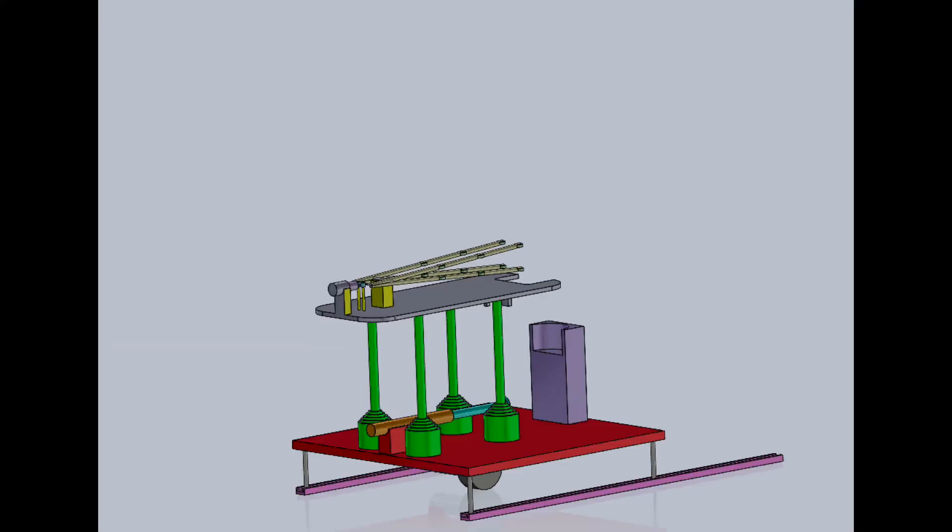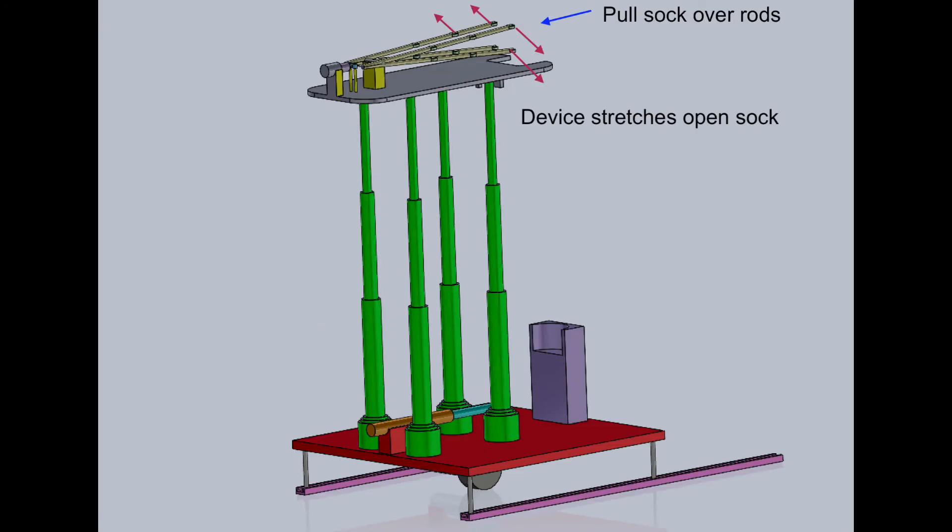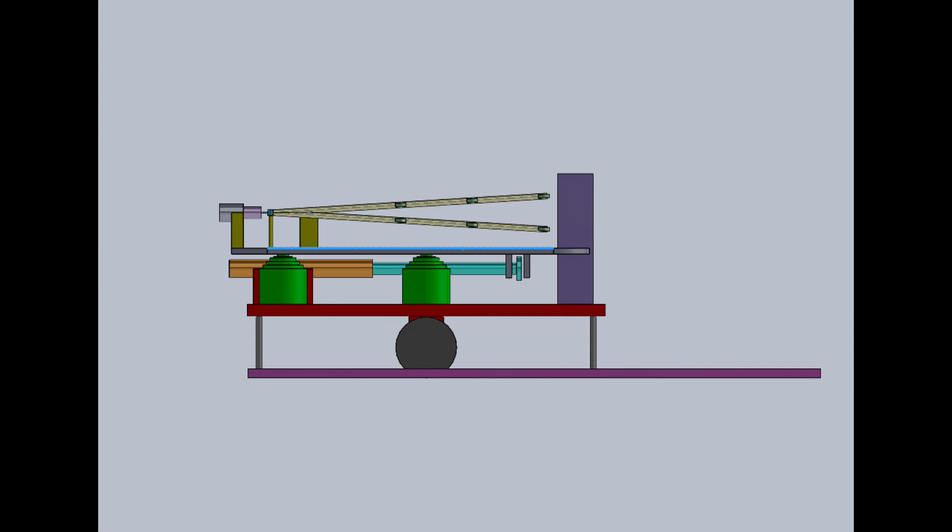It uses a number of motors, linear actuators, and rods to move to the user's waist level, stretch open the sock, and then slide the sock onto the user's foot.